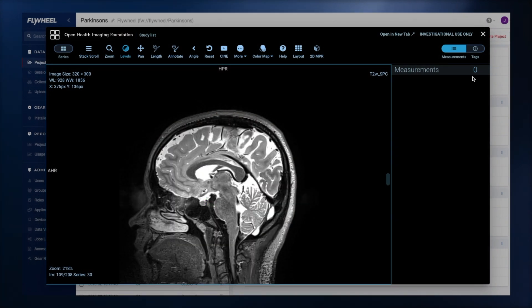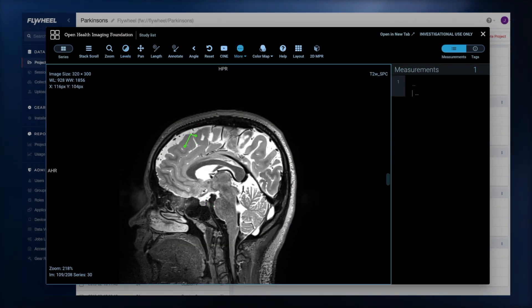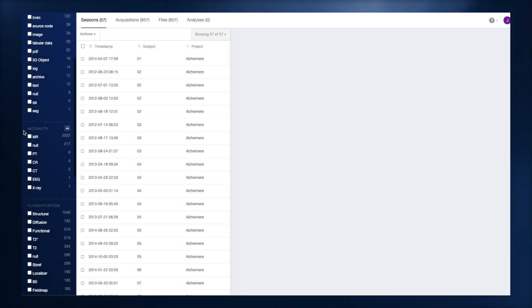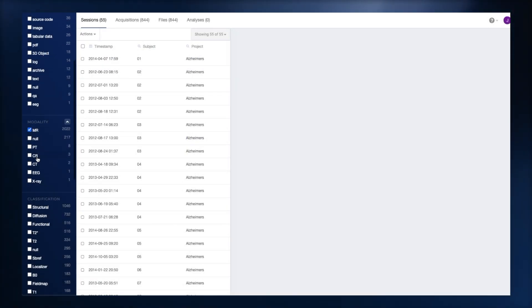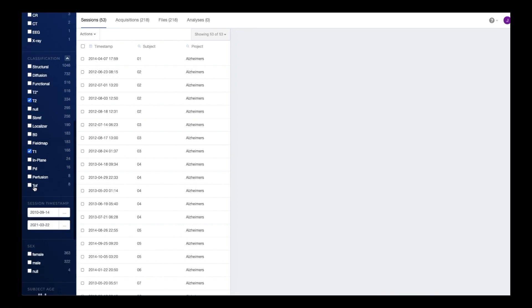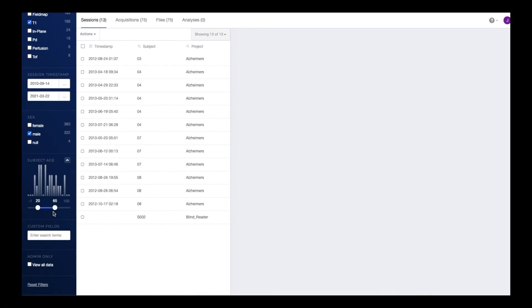Our DICOM viewer also includes annotation and labeling tools. With our fast and powerful search tools, you can quickly and easily curate potentially massive datasets by performing searches that key on both standard and custom metadata.